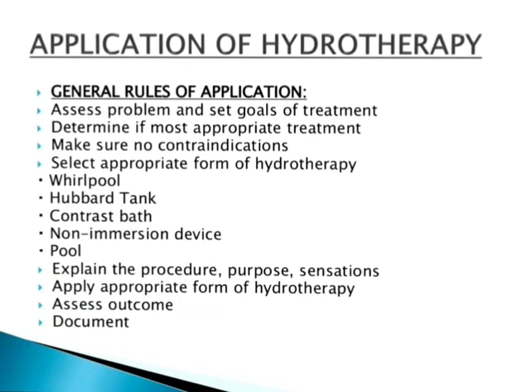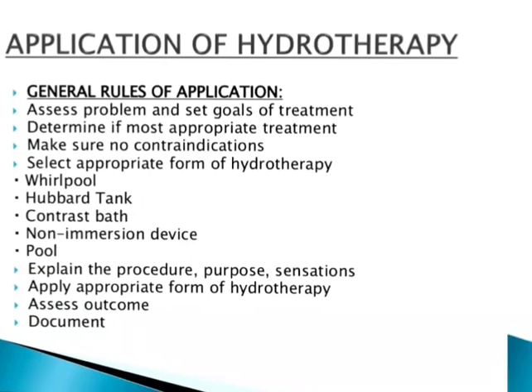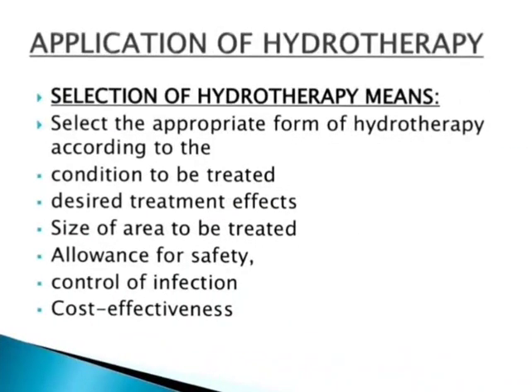Then we have to explain the procedure, purpose, sensations, everything to the patient. And we have to apply the appropriate form of hydrotherapy. And then we have to assess the outcome, and make notes or document that.